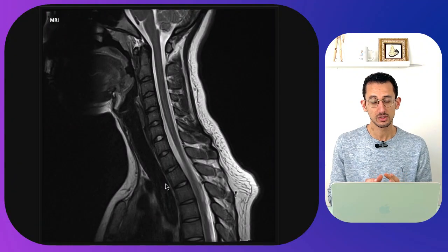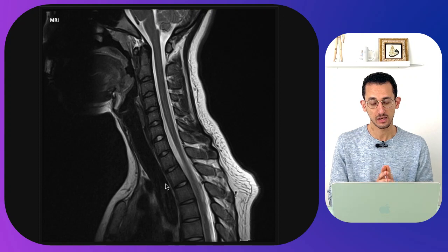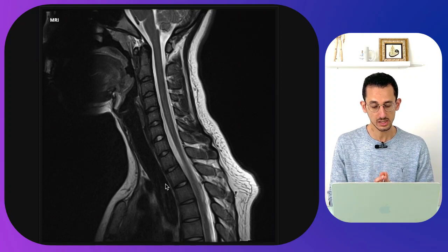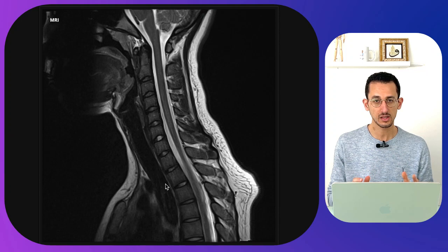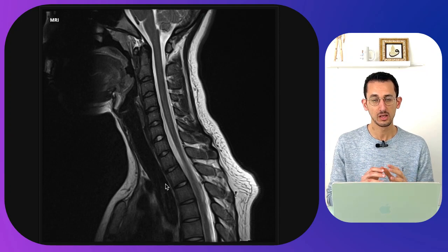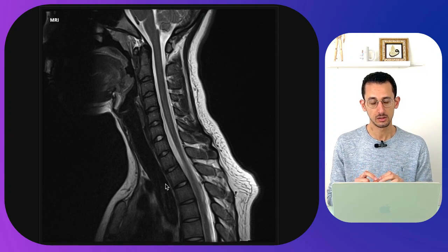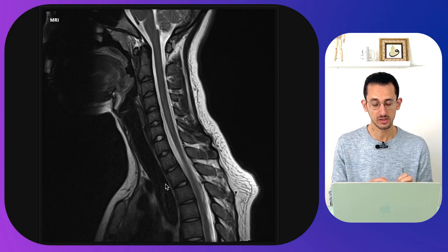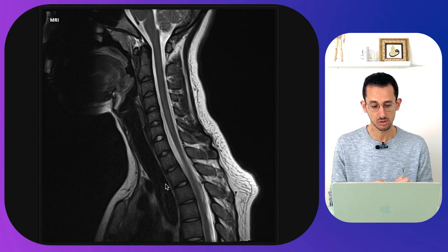Let's have a look into this normal MRI scan of the cervical spine. When you look into the MRI scan the first thing you want to do is look at the appropriate sequence so that you can identify the anatomical structures.